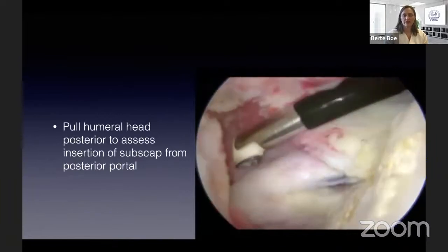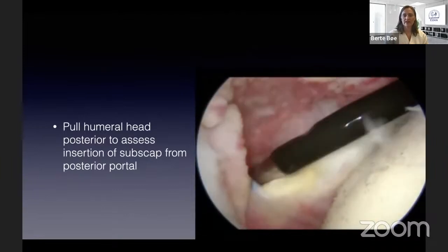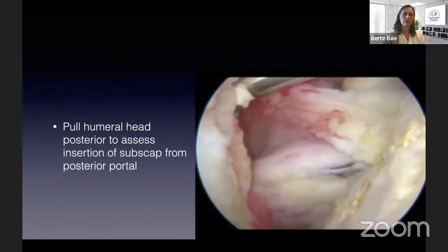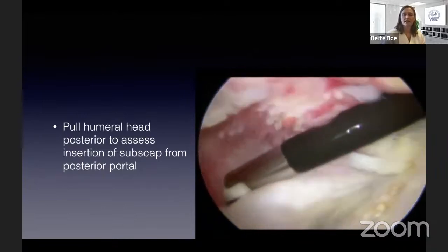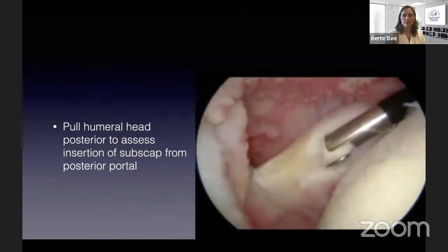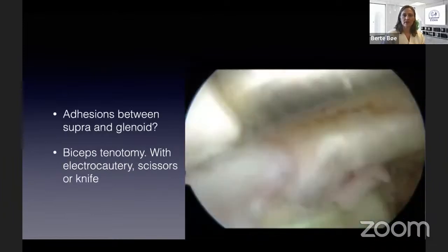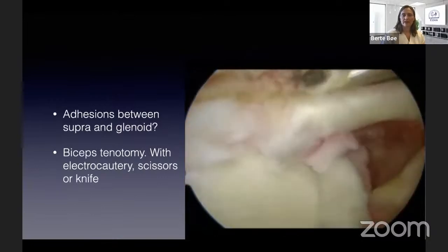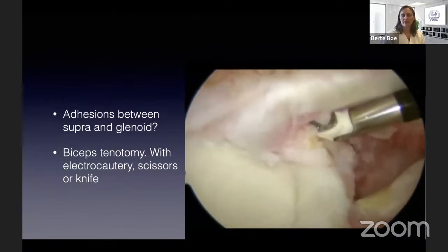So this is how I consider if I have a tear in the subscapularis. In this case, it looked almost normal when you have your camera in the posterior portal and you look around the humeral head. Looks nice in the beginning, and you push backwards and you see that there's a partial tear in the subscapularis. So this is an important step. And I also palpate and release if there are adhesions above the labrum underneath the supraspinatus.